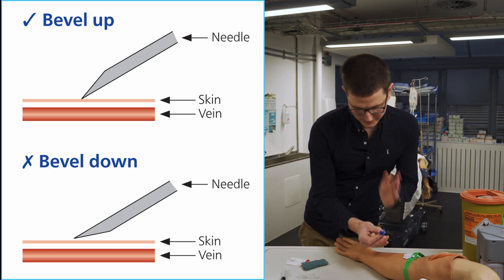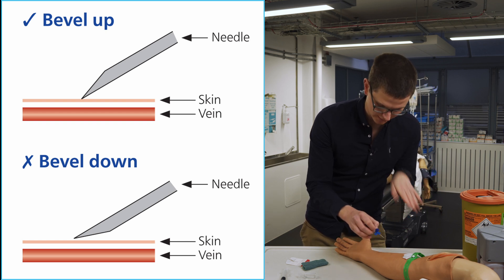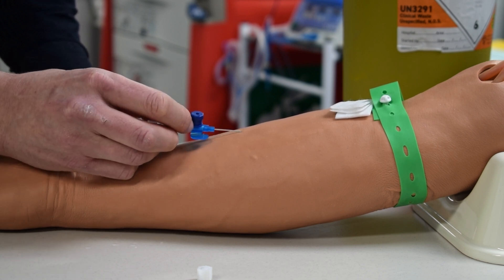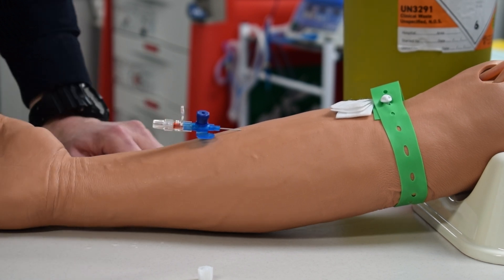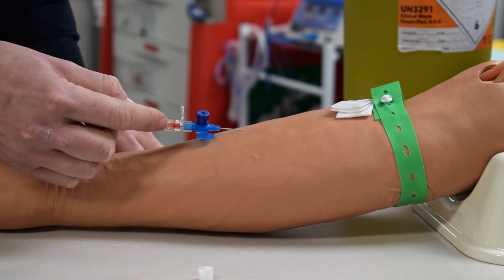The other point is that there is a bevel — a curved edge and a pointy edge. The bevel must be facing up so that it digs into the skin. You find the vein and you push, push, and push until you feel a give. There we go — I felt that give.